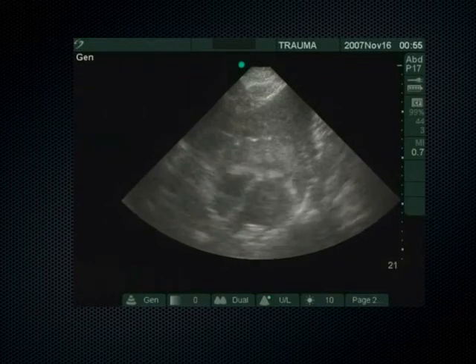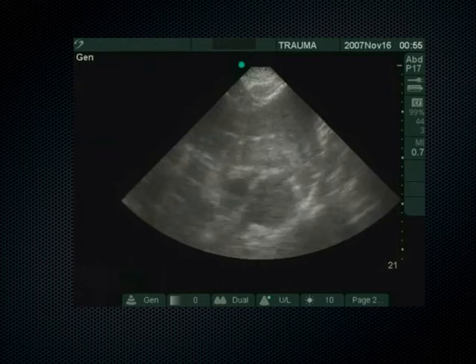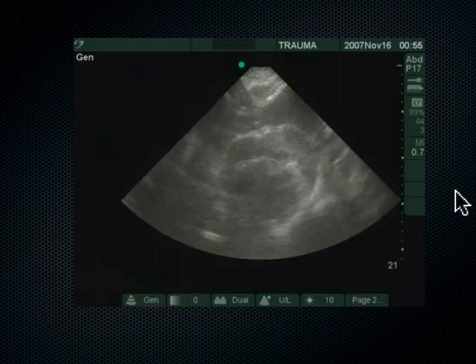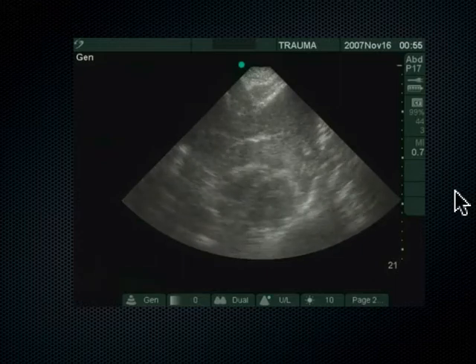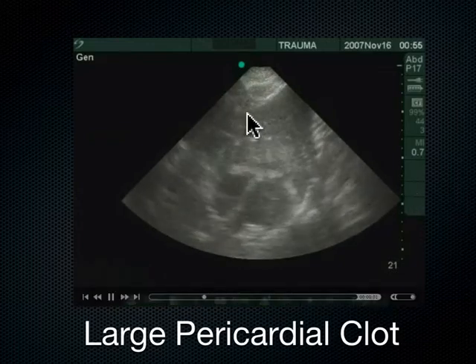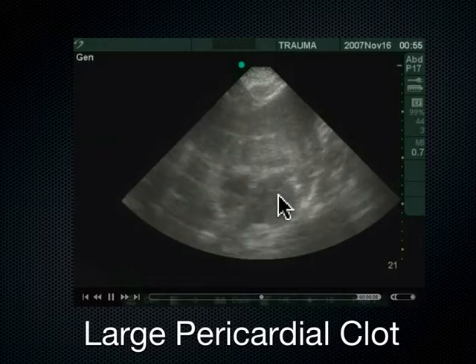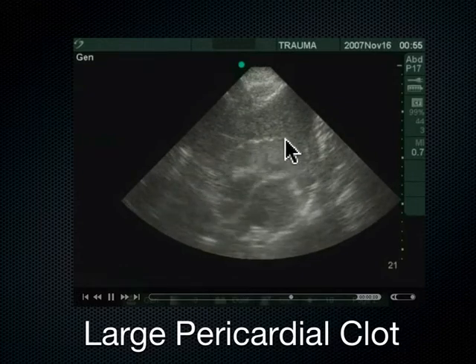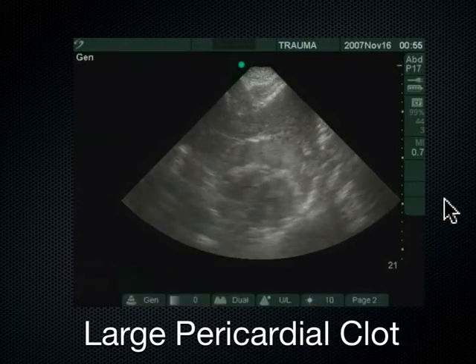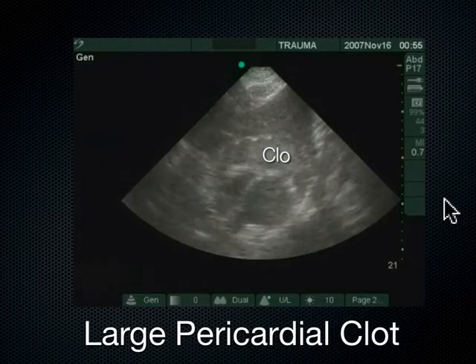What's the diagnosis? Yeah, I like that. Tamponade, why? Huge clot there. So if this is the liver, and this is the right ventricle, left ventricle, this is what view of the heart? Subxiphoid. The pericardium's out here. This is all isoechoic clot. If this happens, and we see this in our trauma bay, what do we need to do?